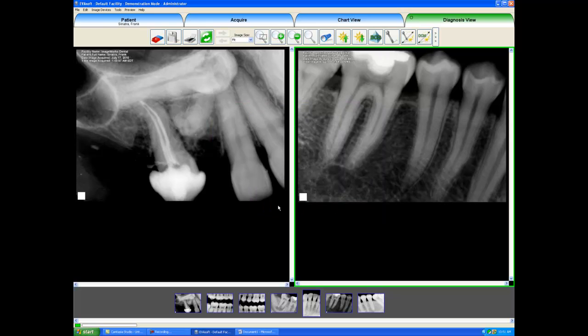With that loose file, I could then attach it to an electronic claim. I could paste it to a Facebook wall. I could burn it to a disk. I could print it. I could attach it to an email.